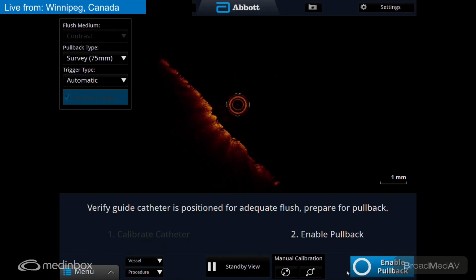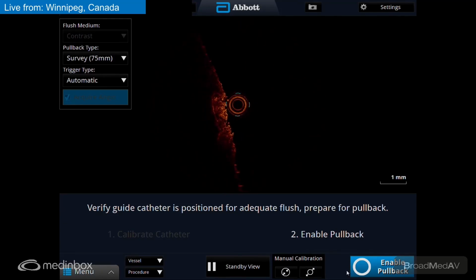Thank you. Let's see if I can inflate this at a distal part of the stent. That should do the trick if you get in there. See, now with the stent in, it's really because we're hitting right at the ostium. Might be easier to pull the guideliner back and go sans guideliner here. There you go. Wow, that worked. Let's go to 12. Let's go to 12. Perfect.